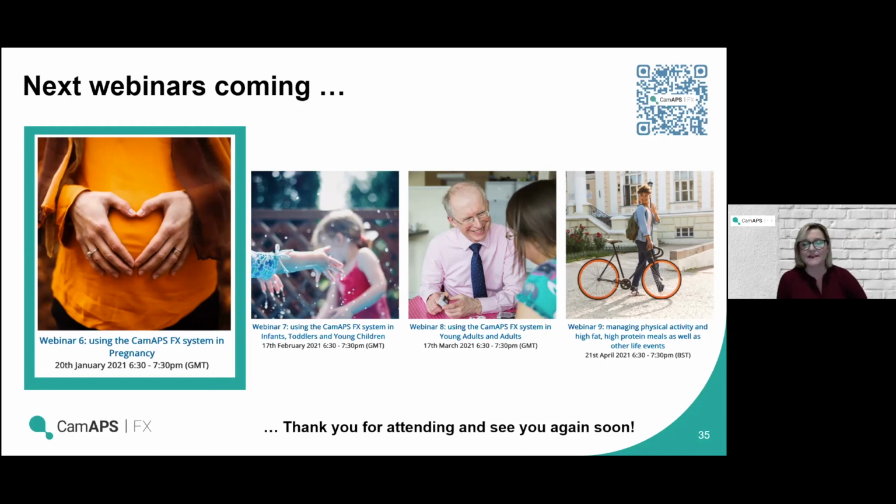Thank you. And then the last one, which links nicely with our next webinar, is how do I stop the set change alarm sounding like a crying baby? We're sorry about that. That was caused by a glitch. So the first important thing is always make sure you've got your most up-to-date update. So if there's been an update, update it.